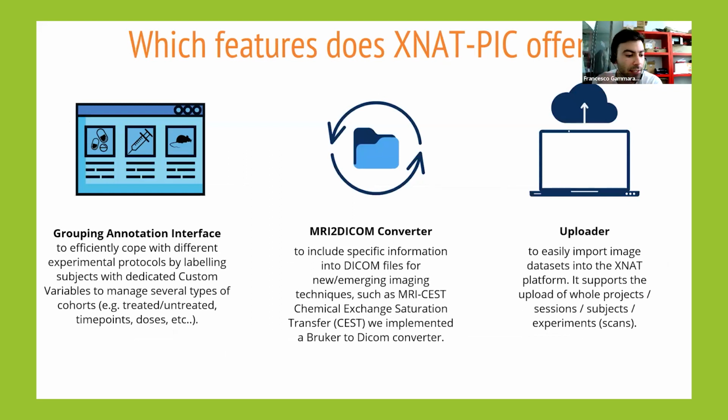So this interface allows you to select your project and you can edit the custom variables that you want to add, such as groups, time point, doses, and so on. And then XNAT-PIC offers a converter to convert Bruker file format to DICOM standard, and we have added the possibility to save some private DICOM tags for new imaging techniques, such as the CEST imaging.